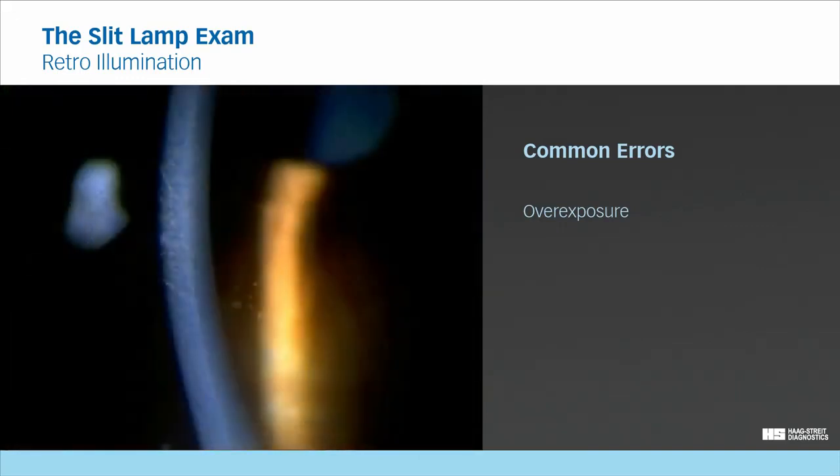When examining the cornea of a patient with light iris, the illumination should be reduced to maintain the contrast of the corneal detail. Here an example where the indirectly illuminated field shows no detail. Here the same view with reduced light intensity. Now the epithelial microcysts are easily visible in indirect retroillumination.